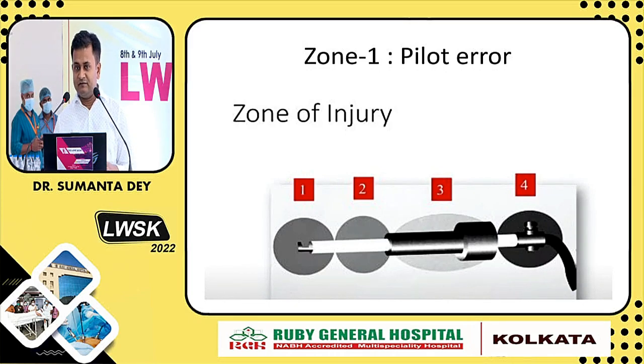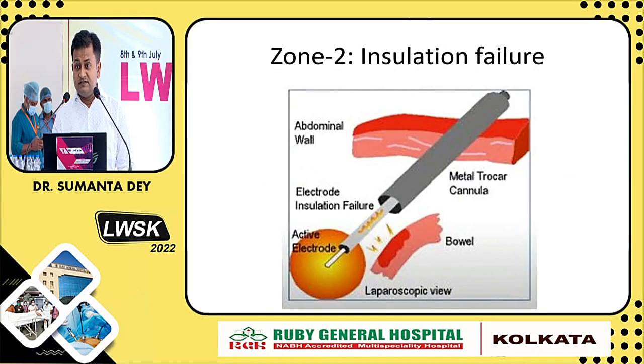You have to train yourself enough and be comfortable with what you are using. So as Anmol said, ergonomics is very important. While using these instruments, these energy devices, you have to be very cautious about it. Then what is zone 2?